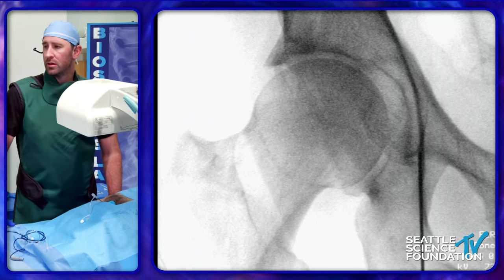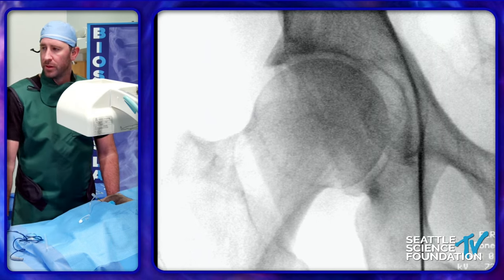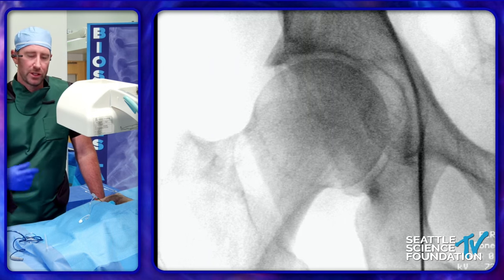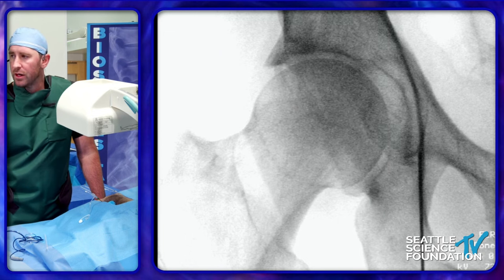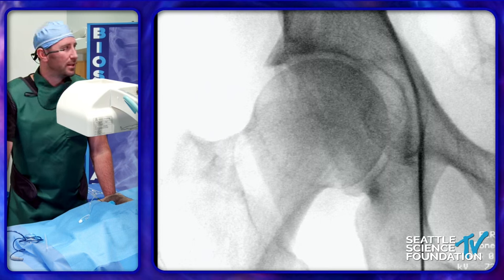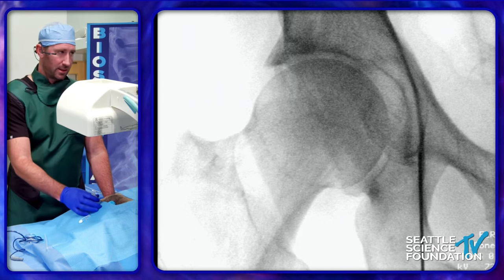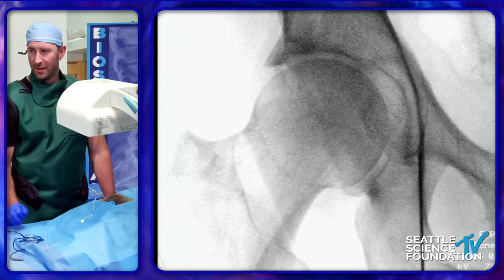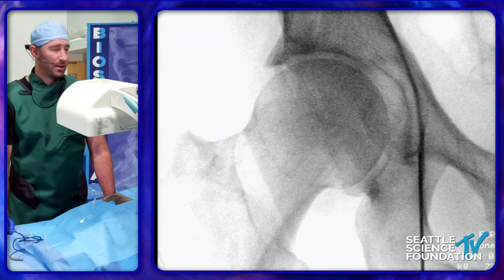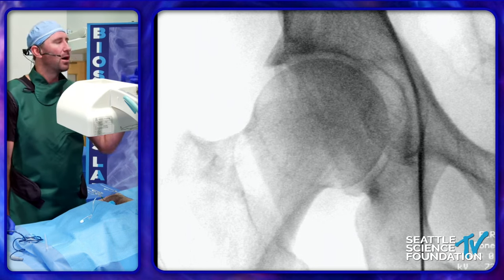We stimulate and test for motor stimulation to make sure we're not getting any muscle fiber twitching in the lower extremity. We're burning at 60 degrees Celsius for two minutes and 30 seconds per lesion to get that very large volume and ablate a large segment of the nerve for the pain relief we're looking for. Regarding ablation zone size: the ablation zone is about 600 cubic millimeters. If you look at a cadaveric dissection of where the articular branches are, they are very variable — so the large ablation size is incredibly important to compensate for that variability.